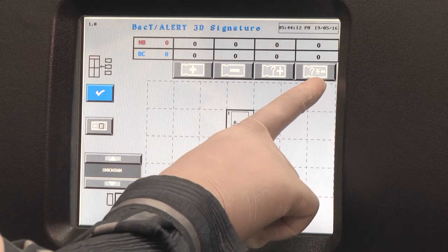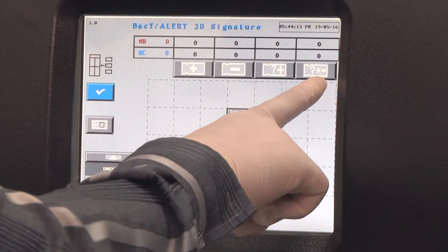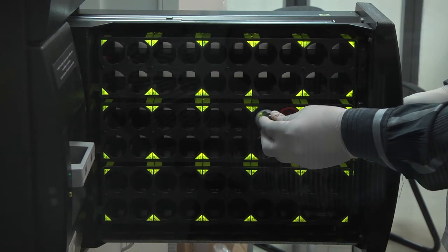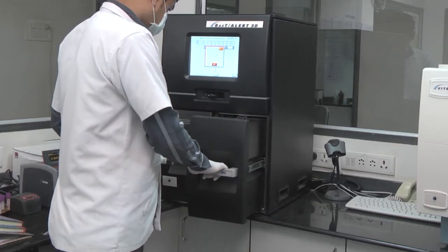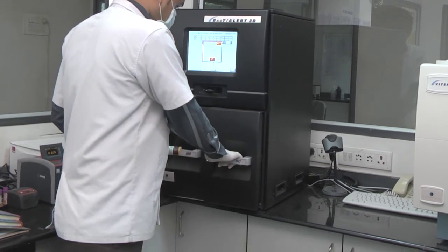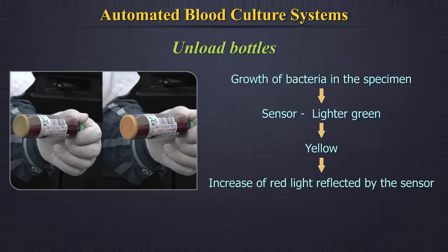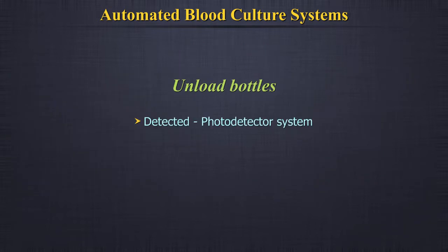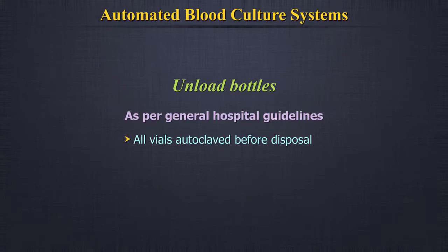To unload bottles, touch the unload bottle icon, whichever is highlighted. The cells which contain bottles to be unloaded will be flashing green light. Unload the bottle and close the drawer. Growth of bacteria in the specimen causes the sensor to become lighter green and eventually yellow, which results in an increase of red light reflected by the sensor and is detected by the photodetector system. All vials have to be autoclaved before disposal as per general hospital guidelines.